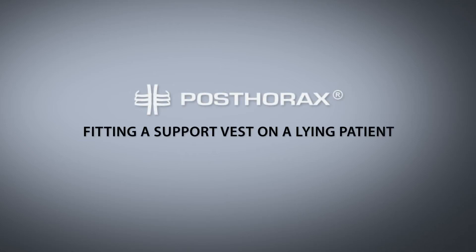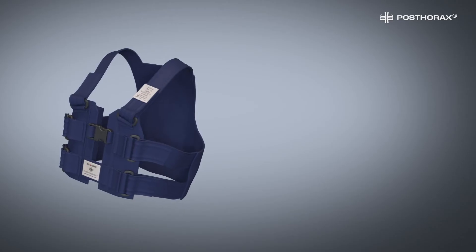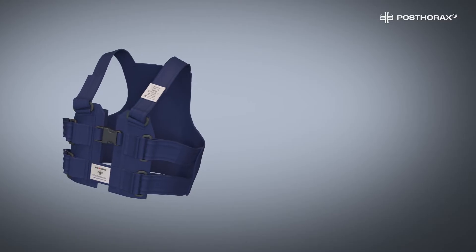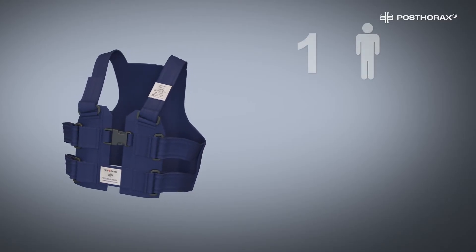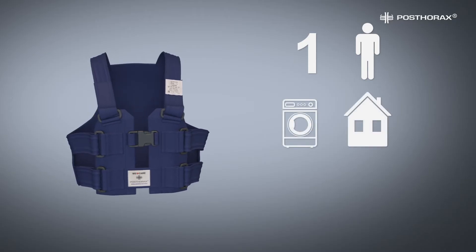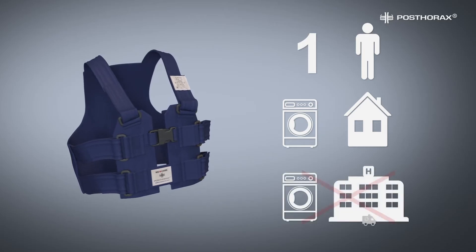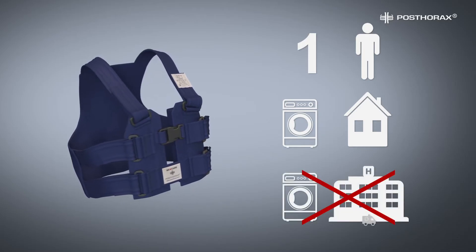Welcome to an instructional session for fitting a Postorix support vest on a reclining patient. Please take note of the following information: the Postorix vest is a single patient product. It is suitable for laundry in a patient's household as directed in the laundry instructions. The Postorix vest is not suitable for hospital laundry.